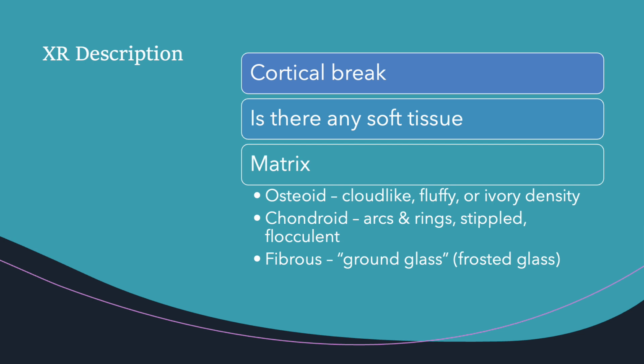Eventually, if there is a break, there will be a soft tissue mass which will be palpable and can be readily seen on CT or MRI. Take note that not all palpable masses on your PE represent a possible cortical break and soft tissue. Sometimes it is just the lesion itself inside the bone which expanded. This may be a sign of a non-aggressive behavior of the lesion.